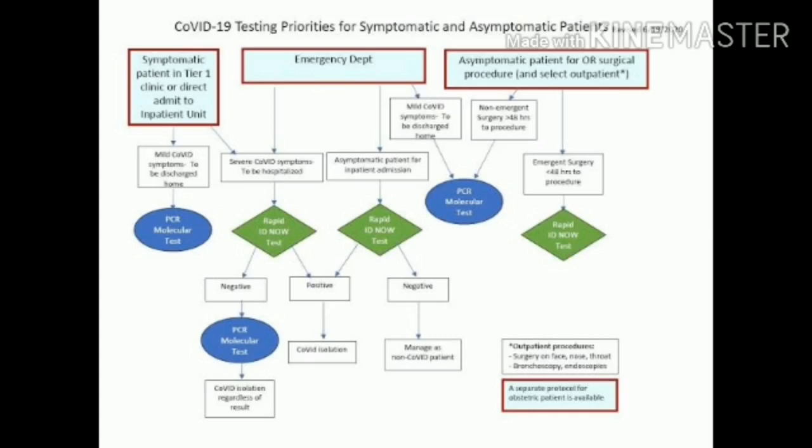or 2 inches. Leave the swab at this depth for a few seconds while gently wiping the wall by twisting the swab shaft. Slowly and gently remove the swab. Immediately insert the swab into the sample collection tube, which may contain 2 to 3 milliliters of viral transport media.